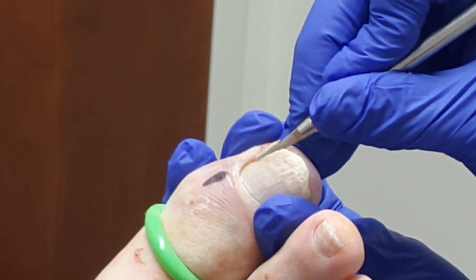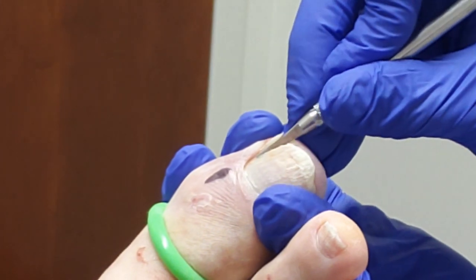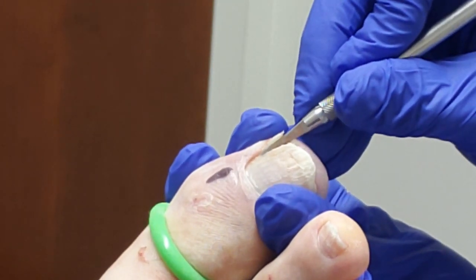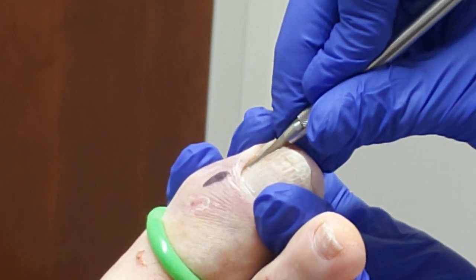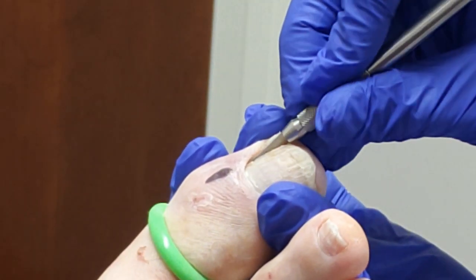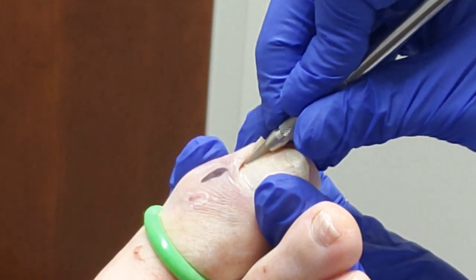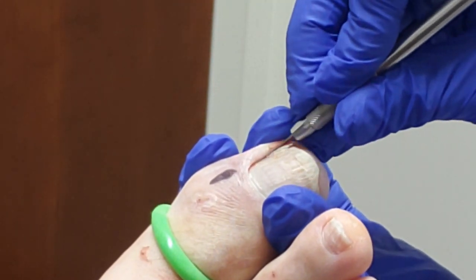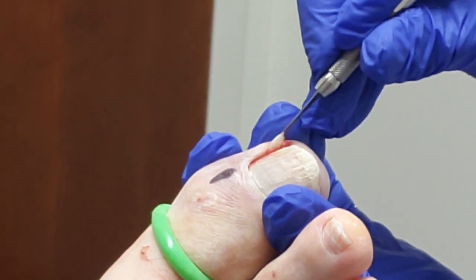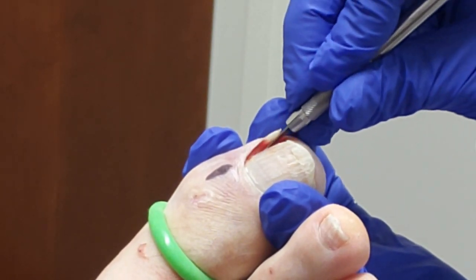The one thing you have to be aware of is back pressure. Because as you do this, the nail is kind of hard and sometimes it just goes and cuts. So you have to be careful it doesn't cut the skin — it goes right underneath the skin there. You don't want to cut the skin. And then you go all the way back, and then I use it to free up the nail on the top and then on the bottom.